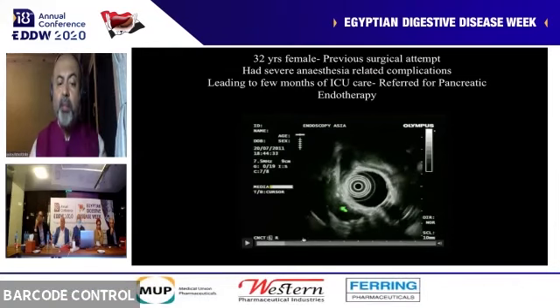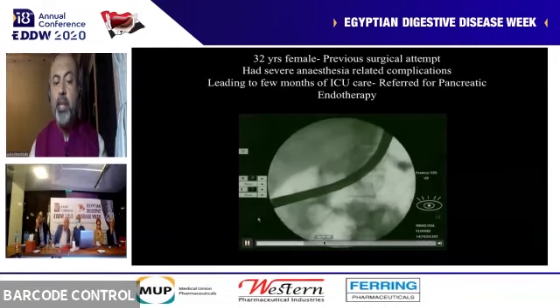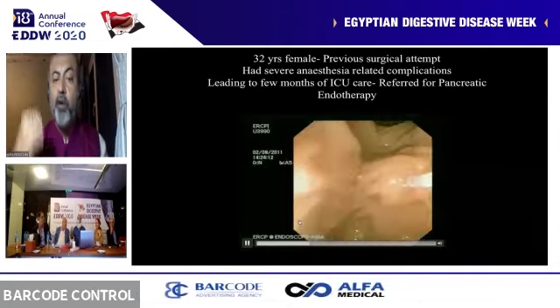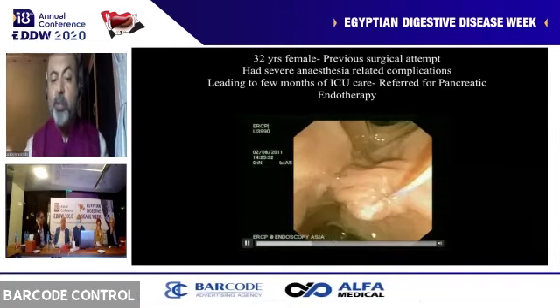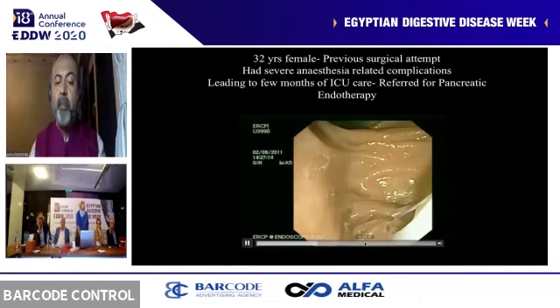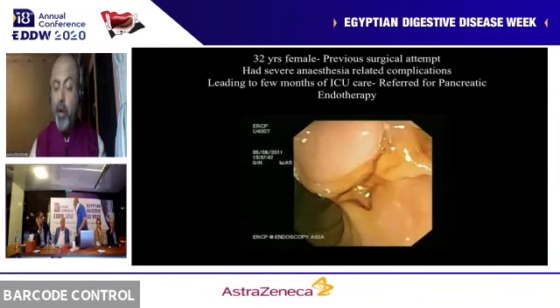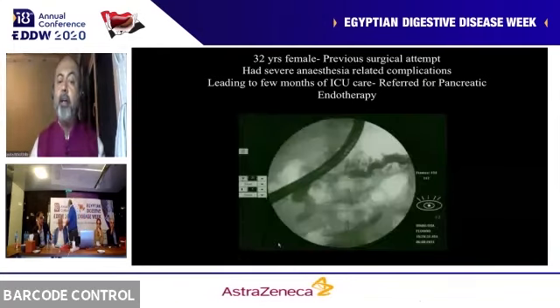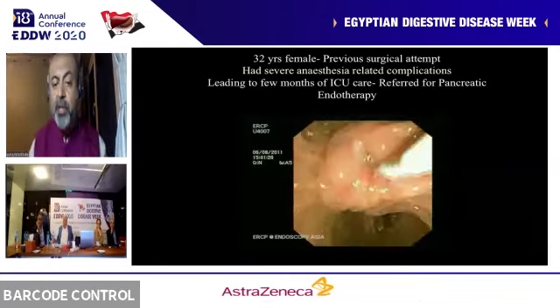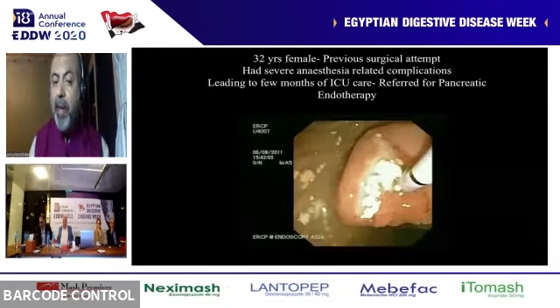Here we placed a pancreatic catheter, and then we managed to do ESWL. I placed a nasopancreatic catheter, and the patient was sent for ESWL in the same hospitalization, and then we cleared the duct completely after 5 days. So in one sedation, you can clear all this with a very aggressive pancreatic endotherapy protocol. I'm very proud to say that we have probably hundreds and hundreds of such patients where we have dealt with only endotherapy purely based on EUS mapping.